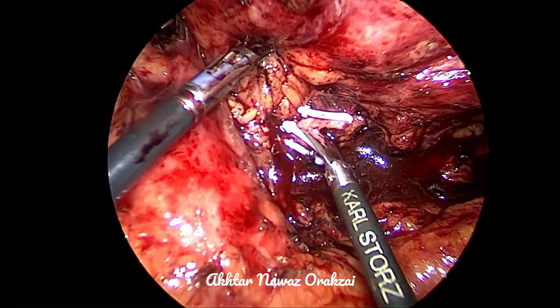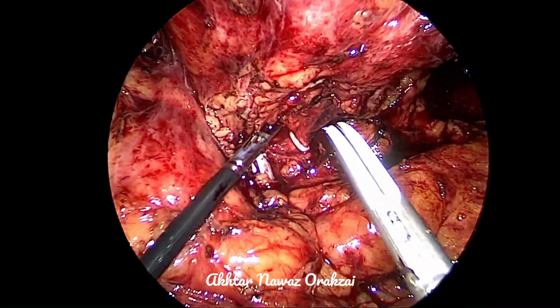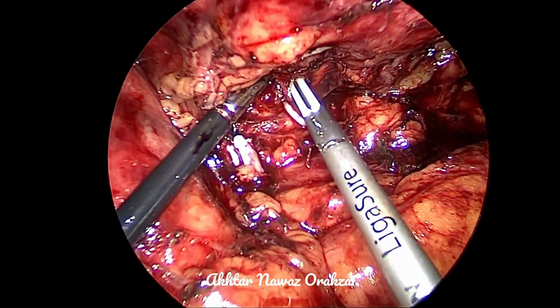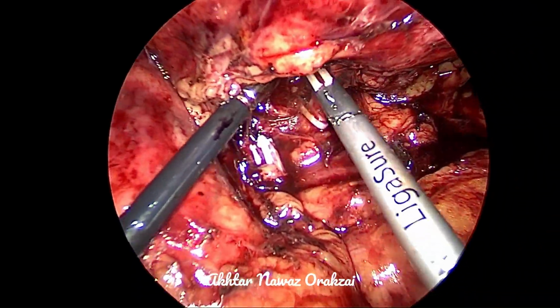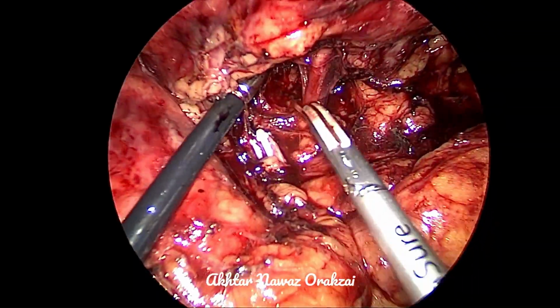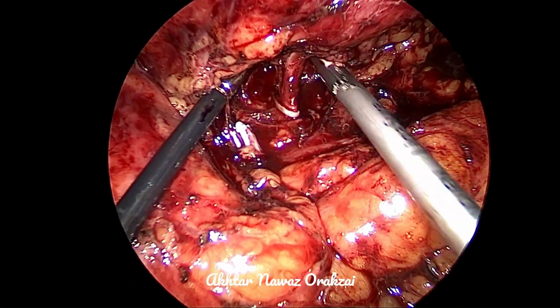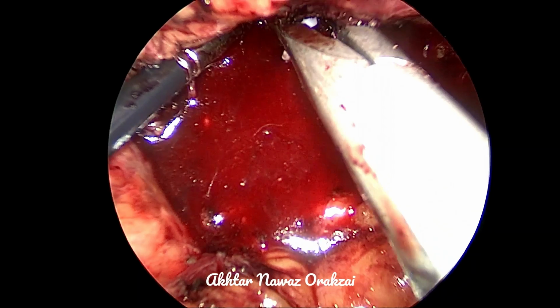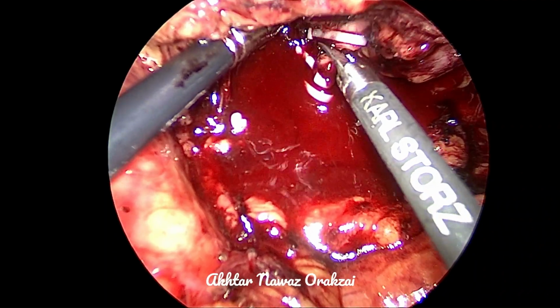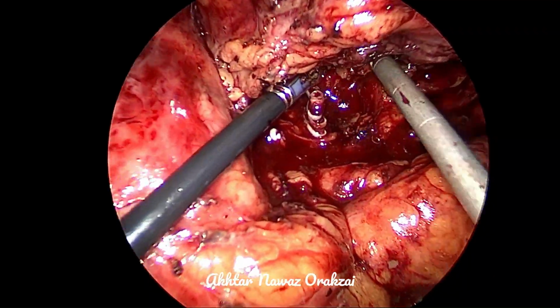So here you can see that we have applied a lot of clips. One more clip, of course, medially will be really helpful and will be very much safe. We applied this clip because the second clip was very near to the edge. And now dissecting the artery further. Further dissection of the artery helps us apply more clips.